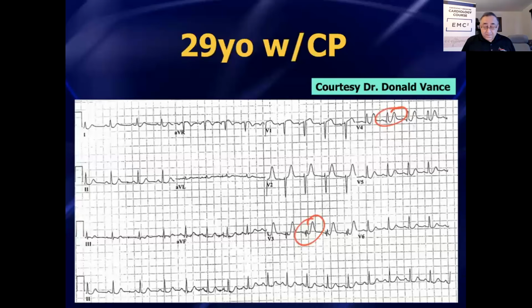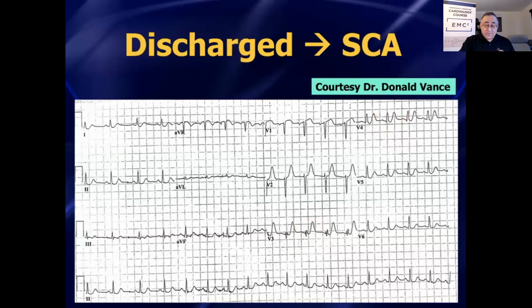The physician ended up going with the computer interpretation and unfortunately discharged the patient, and the patient ended up having a sudden cardiac arrest. Dr. Vance, who provided this EKG to me, was very kind, and he said, please share this case with everybody. I don't care if you use my name, but I want everybody to know about this hyperacute T wave finding so they never miss a case like this. He's retired since his case, but he was very gracious and wanted me to use his case in teaching it to as many people as possible.